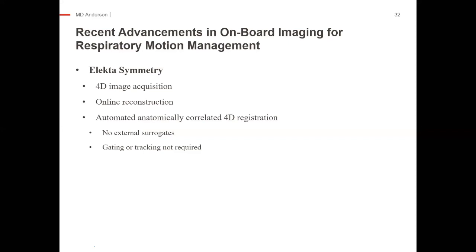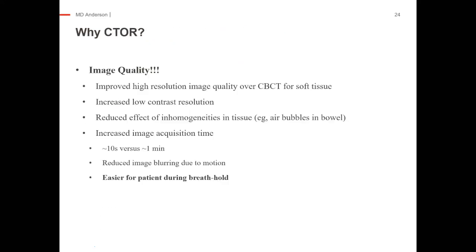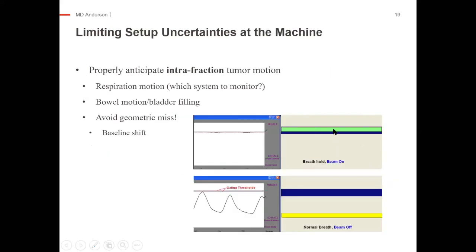Right. Another question is, do you typically have to educate the patient on how you're going to do the immobilization process, with like breath hold and then the compressor? Do you kind of like talk them through it? Yes, that's actually a big part of the success of doing a breath hold with a patient, kind of talking them through it. We have a visual feedback that helps them also. They actually see in those goggles a little blue bar, and the yellow bar is their breathing, and it turns green when it's inside the blue. So they have that visual feedback and we also talk them through it so they understand what's going on, so that they can breathe in a reproducible manner. Make sure they're not breathing too much in their chest, make sure they're taking steady, even breaths, and that visual feedback is key as well.